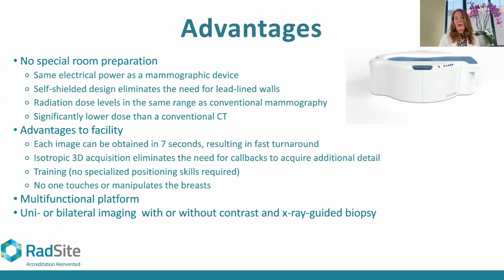So right now, the basic choices are, for most centers, they're going to recommend an MRI and a mammogram and an ultrasound. Other centers also have a thing called contrast enhanced mammography, which is where we inject a little bit of contrast and then do a regular mammogram. That's also that 2-dimension. We're not getting the same 3-dimensionality. When I get a patient that is a high risk patient and I get a contrasted cone beam breast CT, we like to call it VeraScan at our center.